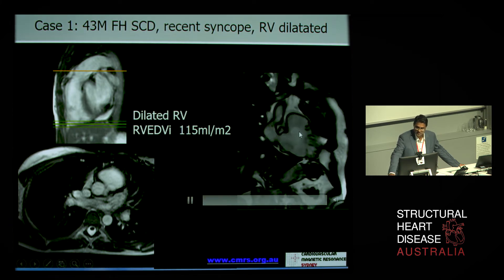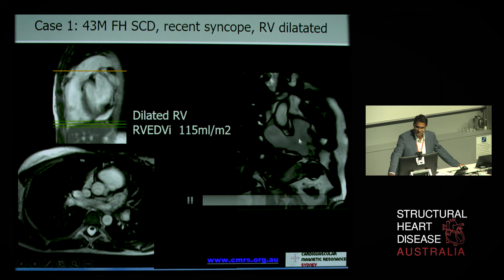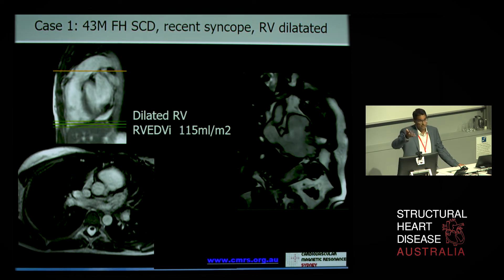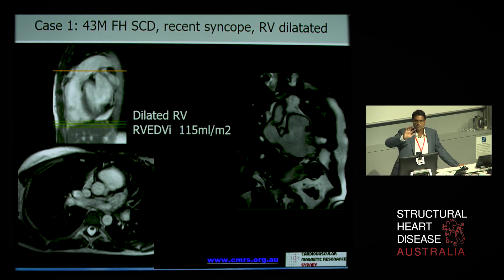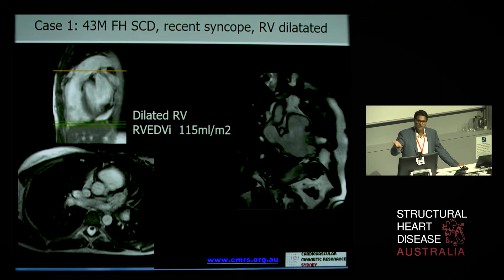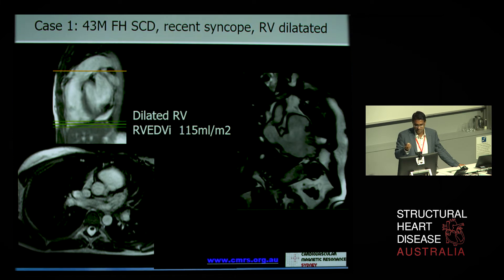Just under the pulmonary artery, there is this very unusual outpocketing, thinning of the right ventricular outflow tract. It normally is quite thin, but there's this paradoxical wall motion — this outpocketing in ventricular systole — which represents this very unusual territory. So very marked regional wall motion abnormality, which is very typical of what we might see with ARVC.